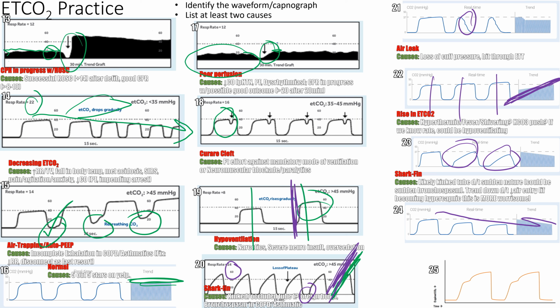24. Good, so it's going down. What would cause that? Good, decreasing cardiac output. They got a PE happening. If it's going down, are they breathing fast or slow? Breathing fast. We'd have to have the respiratory rate really to assess. We can't really tell from this, but it's either one of those two things.